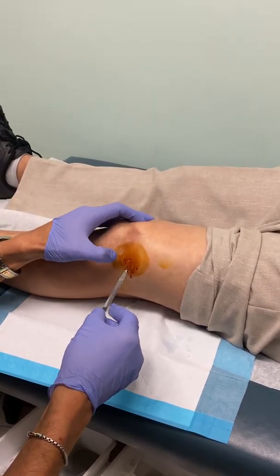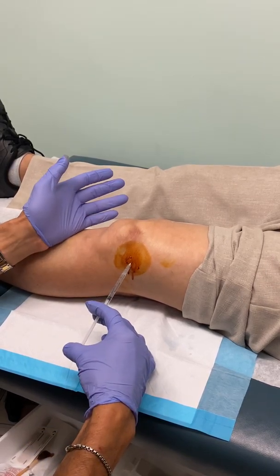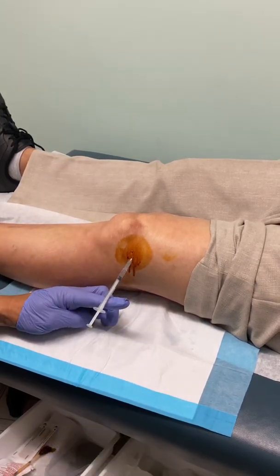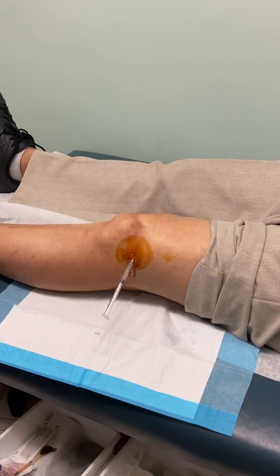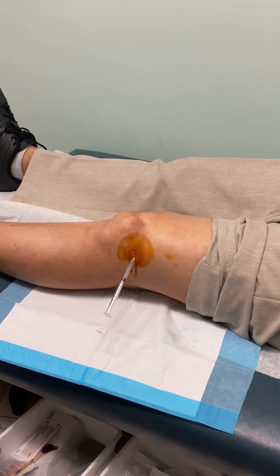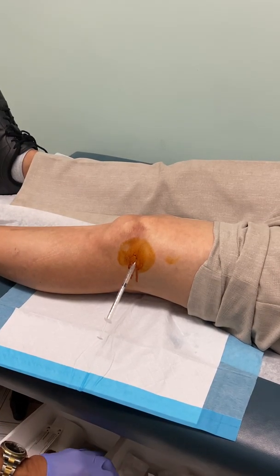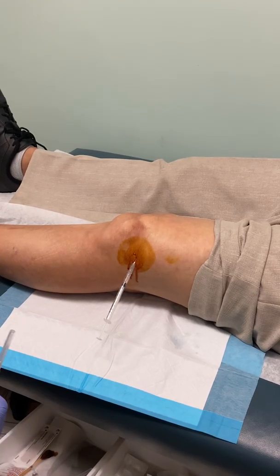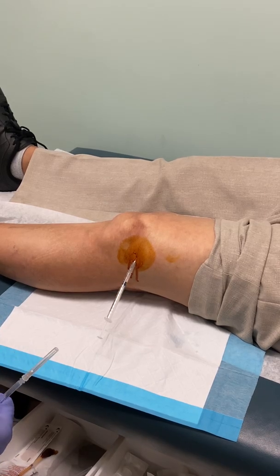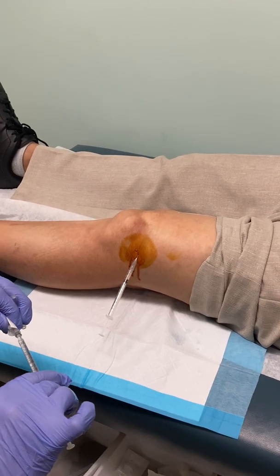You okay? So that felt like I went right in actually — that was a bullseye. I'm just going to leave that right there. I know it looks strange, but it doesn't cause any harm. And get my 22 set up. While I'm waiting, that lidocaine that I injected is actually taking effect, so it's not a waste — giving it a little time to work.